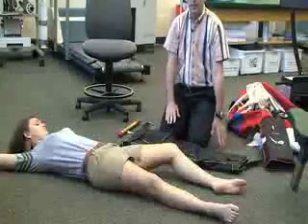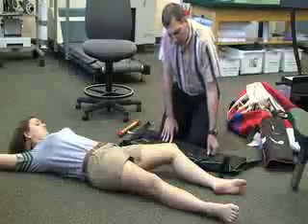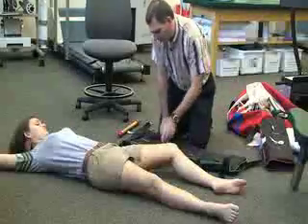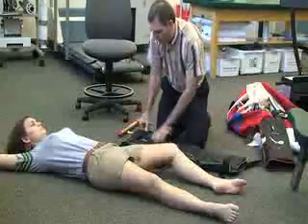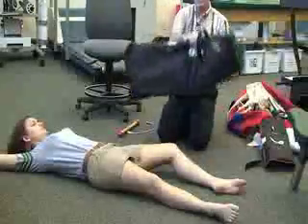Once we have those, after you assess your injury, you want to ask the patient not to move. Try to do as little movement of the body part as possible.